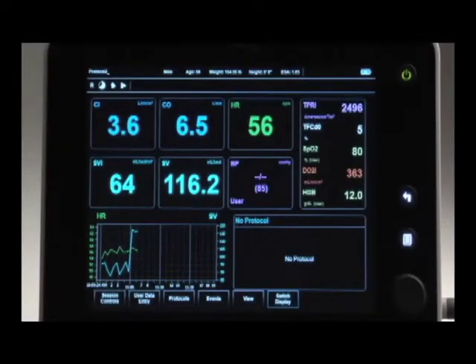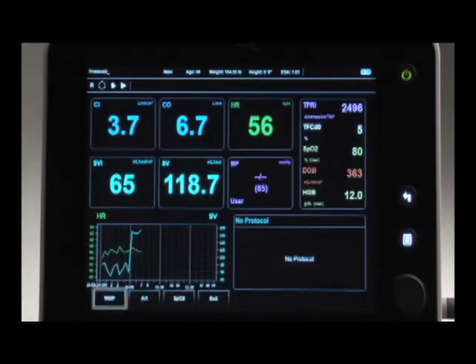The interval for the measurements can be selected from the NIBP soft key in the bottom menu section. Simply slide your finger across the bottom to view this menu option. Lastly, there is an option to connect the Starling SV monitor to select arterial lines. Please ask your local representative for more details.